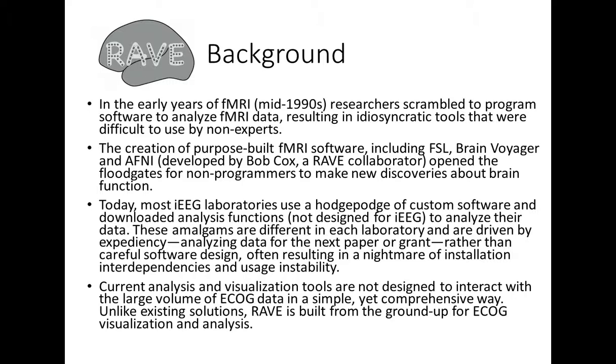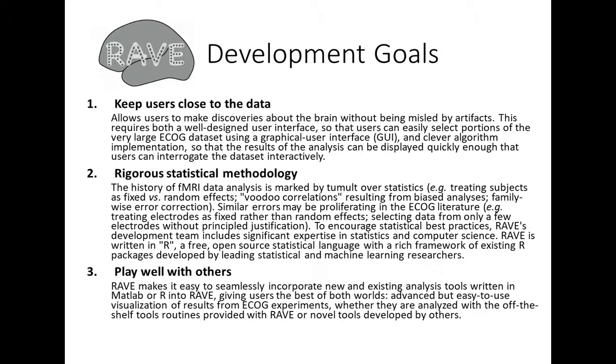So our goal is to create a purpose-built software package that's designed solely for intracranial EEG and has the flexibility necessary to make discoveries about the brain. And our development goals for RAVE, our most important goal is to keep users close to the data. Because the brain is so complicated and there's so much we don't know about it, it's absolutely critical that you have the ability to examine raw data and make sure that you're not misled by artifacts.